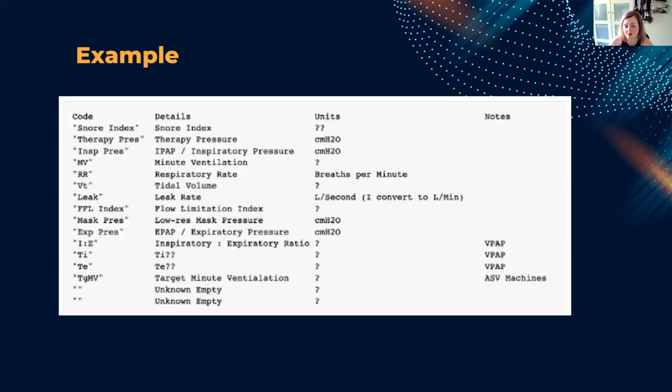Now, this is an example of high resolution graph data, and it tells us more about the airflow as well as events that have taken place. But it doesn't tell us much just looking at it like this, but I will show you how to visualize it better.